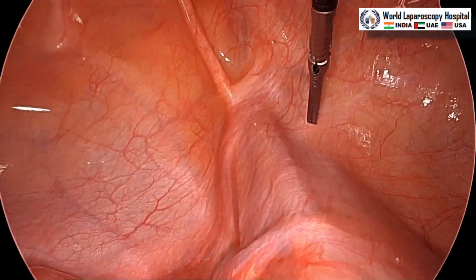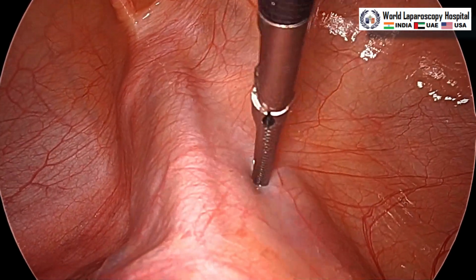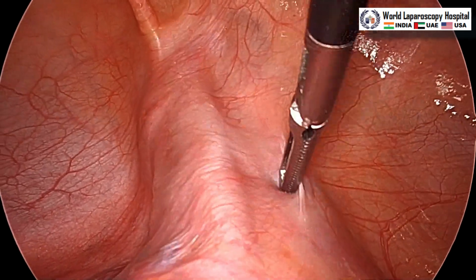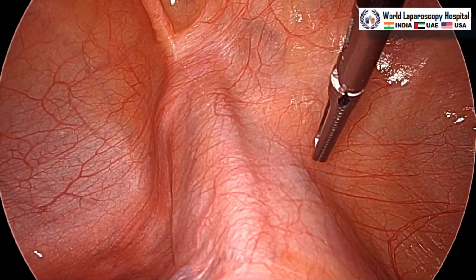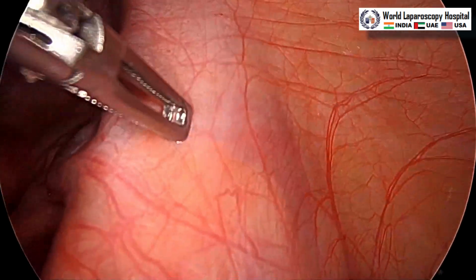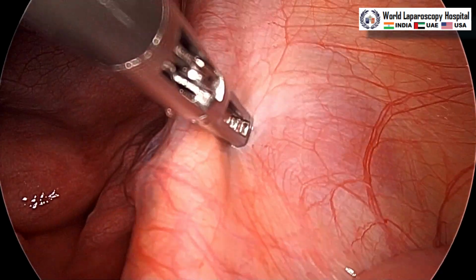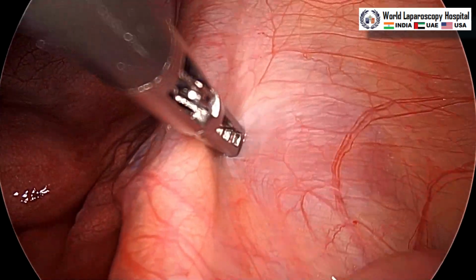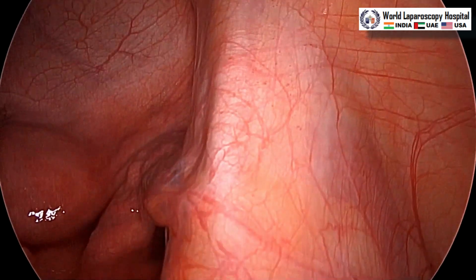This is sitting over the psoas muscle, and this is the psoas muscle, and just lateral to that will be the GFN and LFCN, the lateral femoral cutaneous nerve of thigh, and the genital branch of the genitofemoral nerve. Sometimes the nerve is visible through the peritoneum. Once you move the peritoneum, you can see the LFCN, lateral femoral cutaneous nerve of thigh.